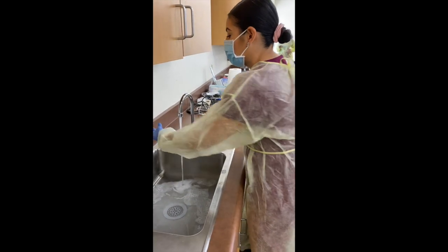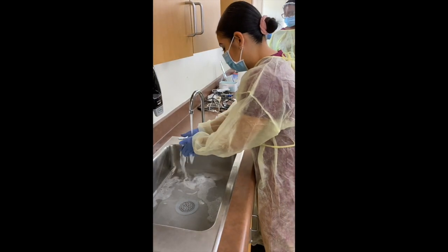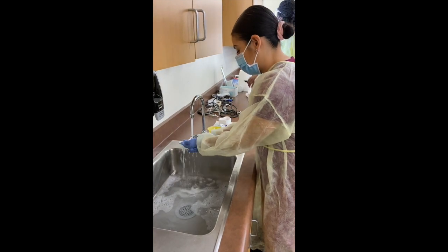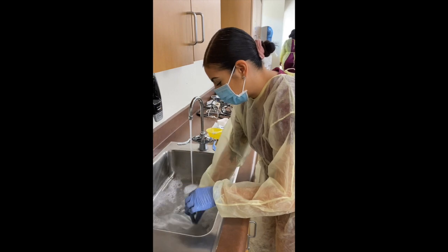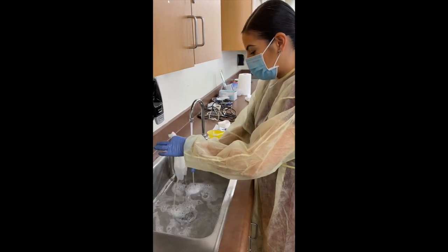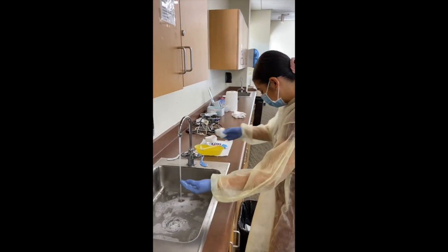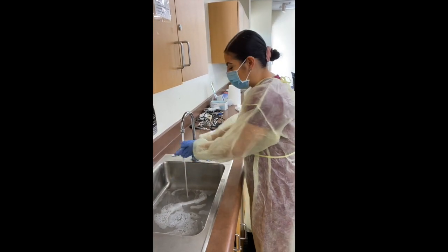I'm going to wash my hands. I'm going to remove the liner. I should have washed my hands after. All right, I'm going to remove the liner. Then I'm going to wash my hands now.